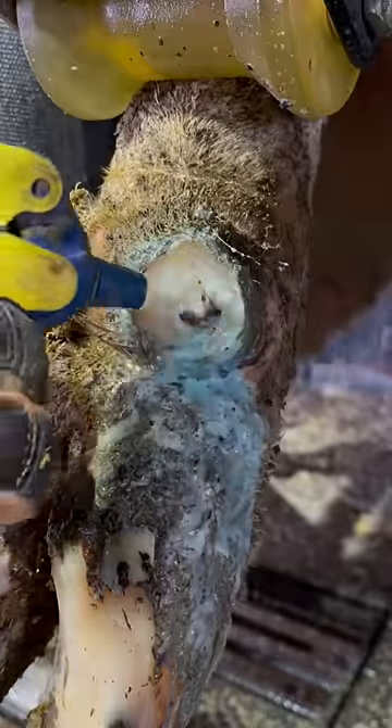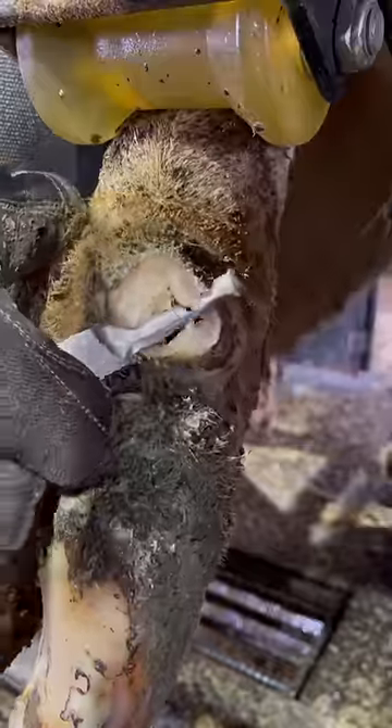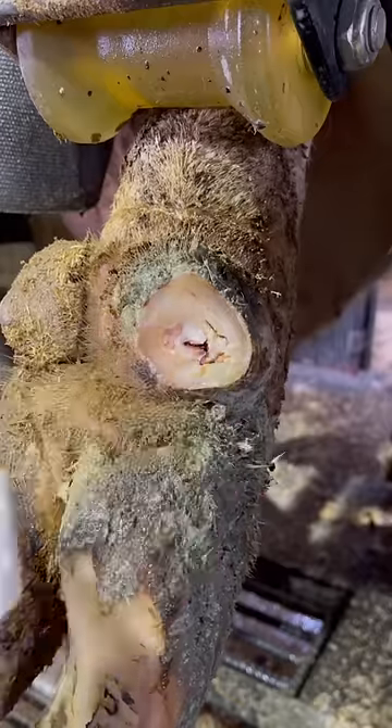And yes, we're getting closer, but we're not there yet. As you can see, we've got a little bit further to go. Now we've got it where we want it, and it's time for some copper sulfate and a wrap. And that's going to do it.